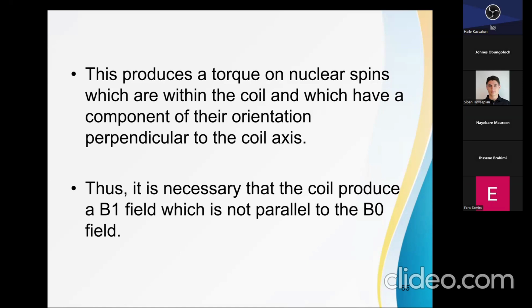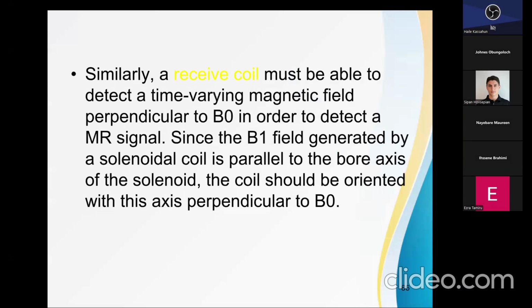So generally, those are the different magnetic fields that we need to generate and constitute the bulk of the hardware of MR: the main magnetic field, the gradient magnetic fields, the shimming magnetic fields, the radio frequency magnetic fields. So if you are building an MR system for imaging, those are the major fields you need to generate.